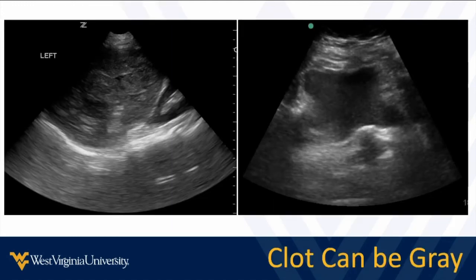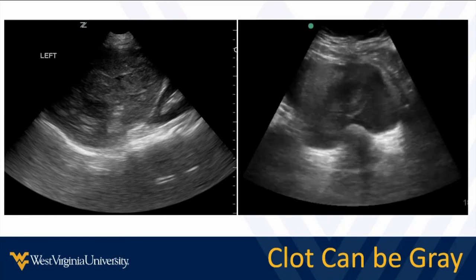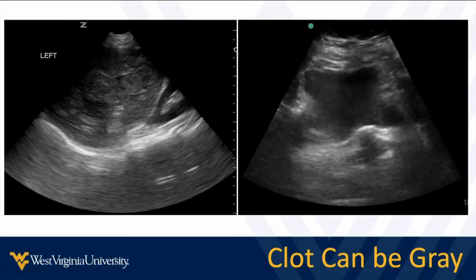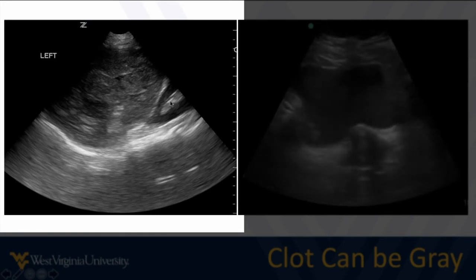All right, so that's all of the anatomy that we're going to look for. We looked at some normal looking structures and landmarks. Very important to find all the landmarks that we care about. Now we're just going to look at some other caveats or things to be on lookout for. One of the things is, here's a case on the left side where we see the kidney. Kidney is pretty small.